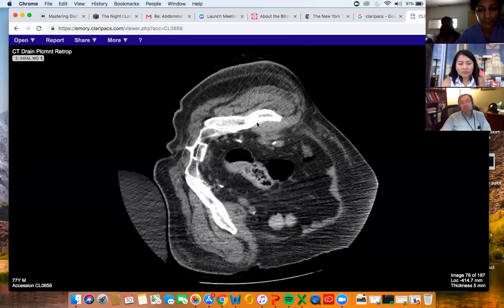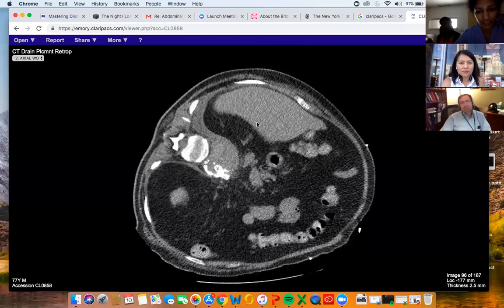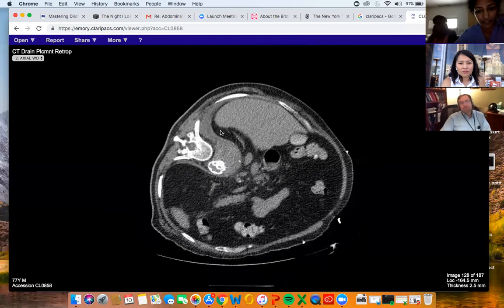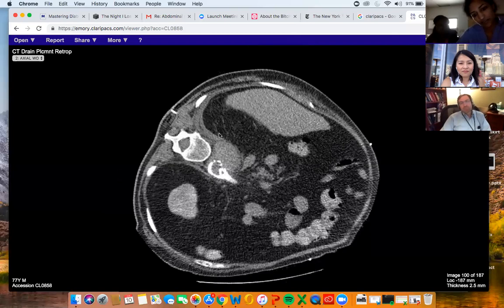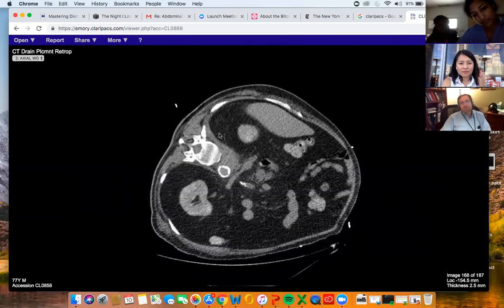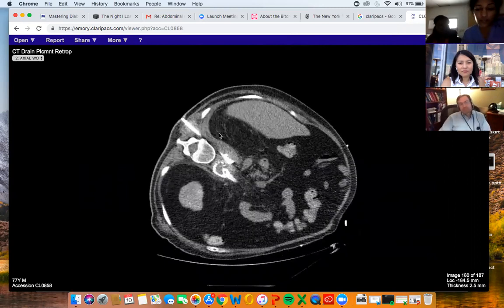In the end, there was the wire. And then there's the drain. And then afterwards, the patient's white count dropped dramatically and is now normal. And so they were very grateful that we put the drain in. It was putting out some purulent material. It did not grow any microorganisms, but it probably still was infected, and maybe the antibiotics had penetrated the area, which is why it wasn't growing.